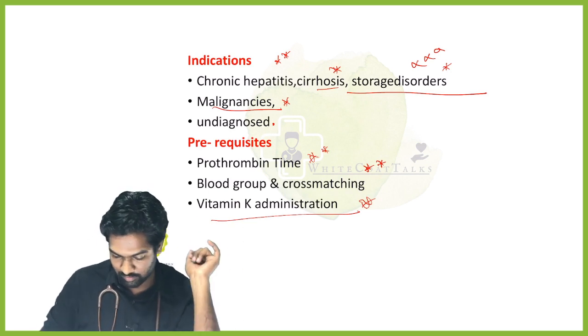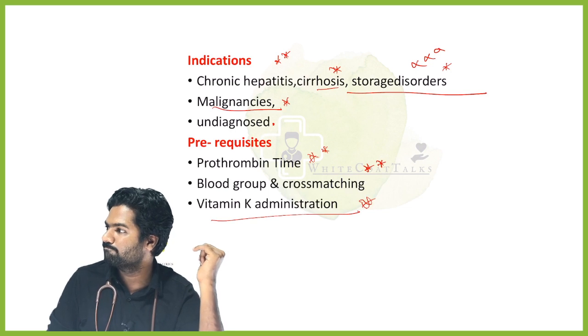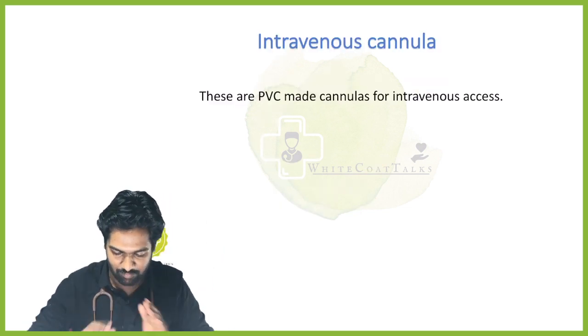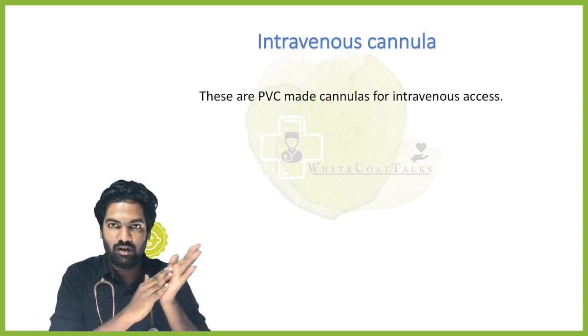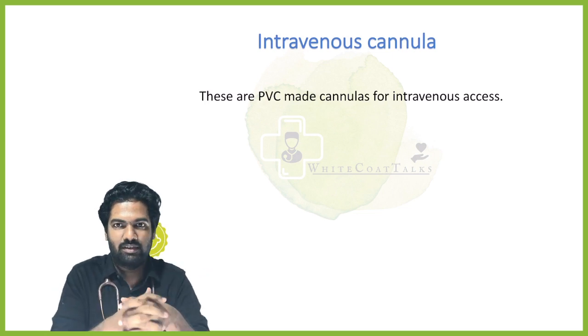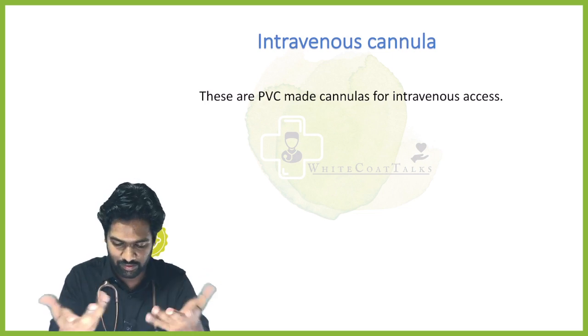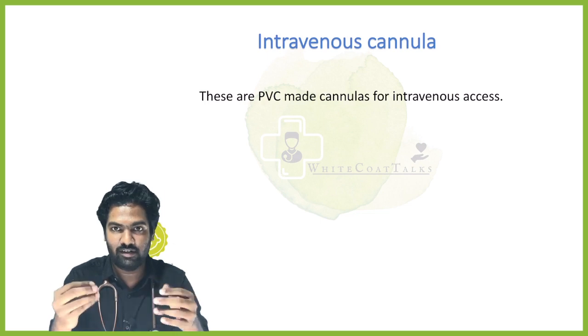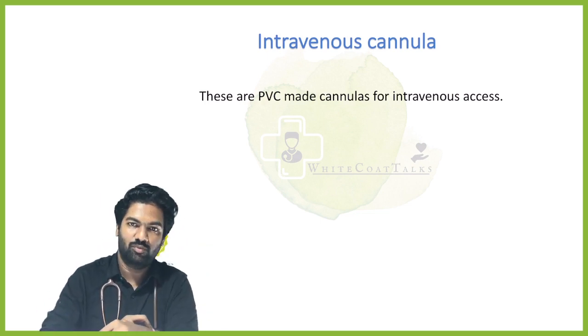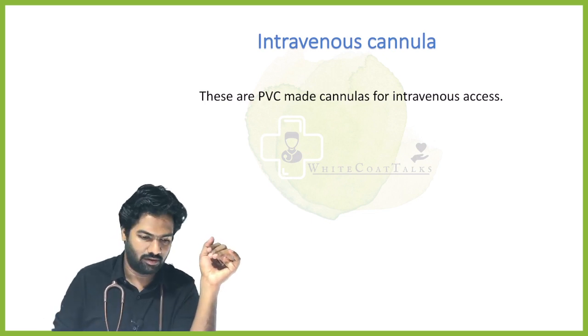Any other questions, sir? Fine. IV cannula, shall we go ahead? IV cannulas are PVC. What is that? Polyvinyl chloride. Please don't say plastic in the exam. They are polyvinyl chloride cannulas for intravenous access, where we want to gain access to any of the superficial veins. We use this IV cannula.